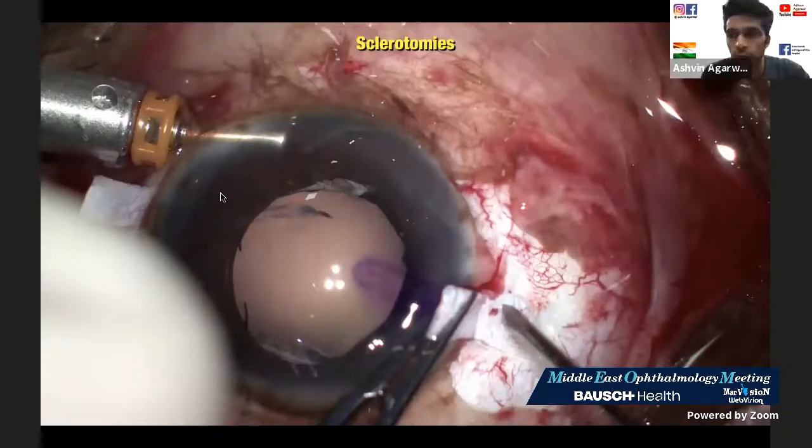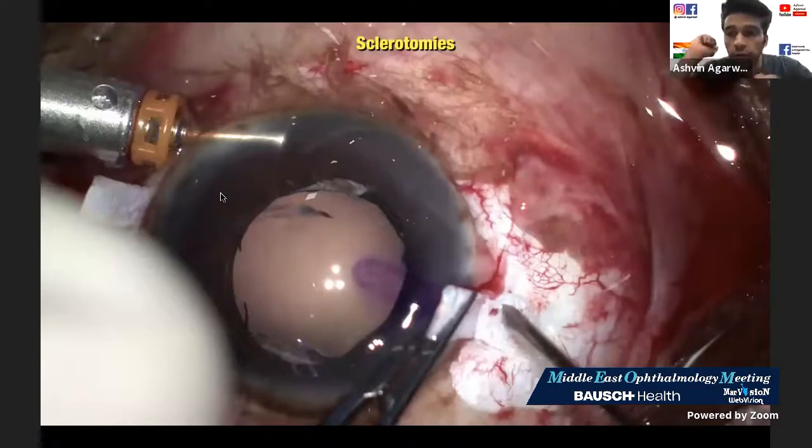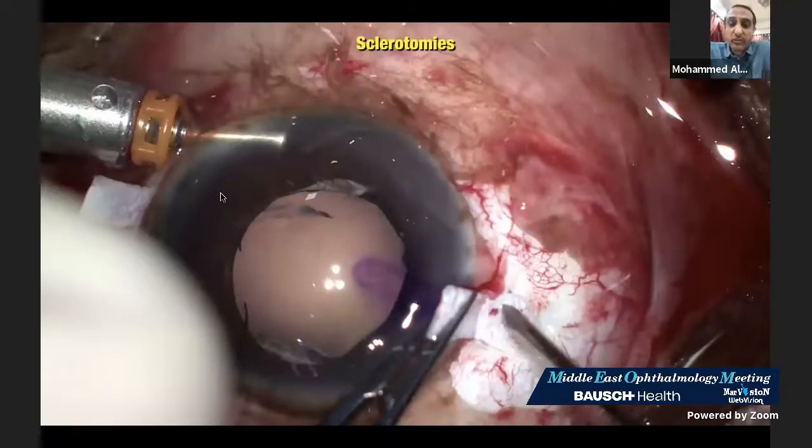Yes, it's going behind the iris. Where is the location that you are going to stop, in the center, or at 2 millimeters? How far from the limbus? Good. So I lift the flap up and I go 0.75 millimeters or 1 millimeter behind the limbus. Okay, that's the point, that's the blue limbus.